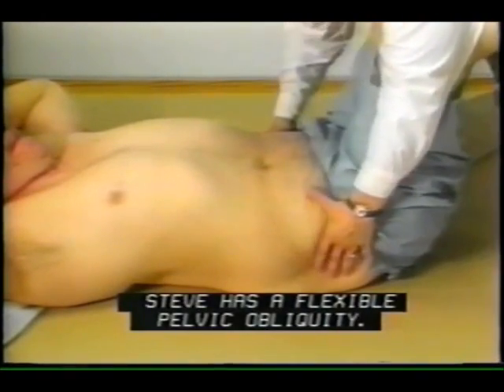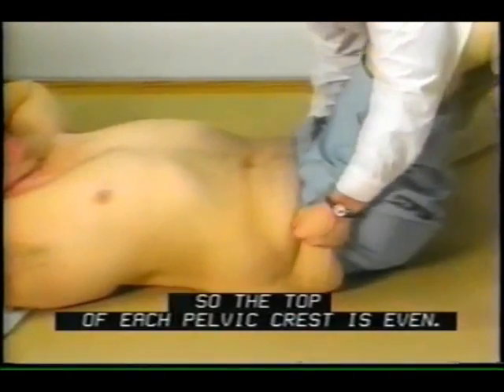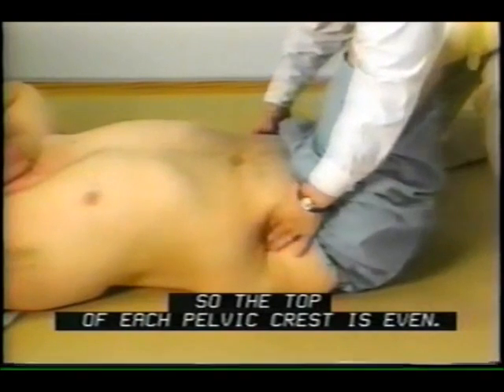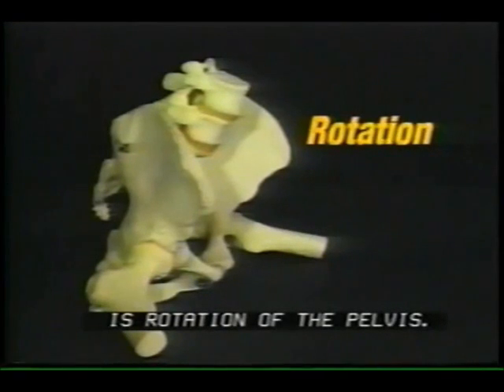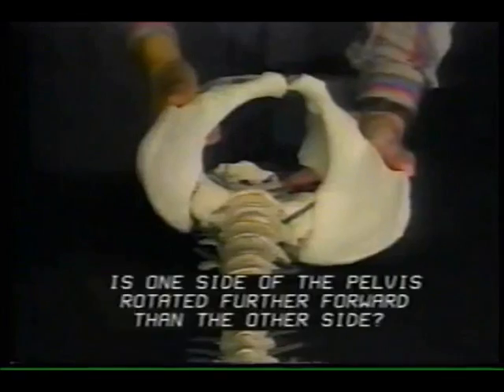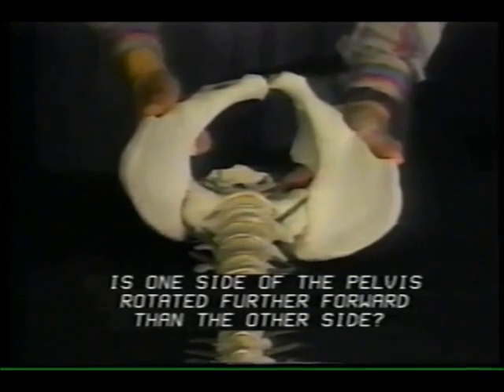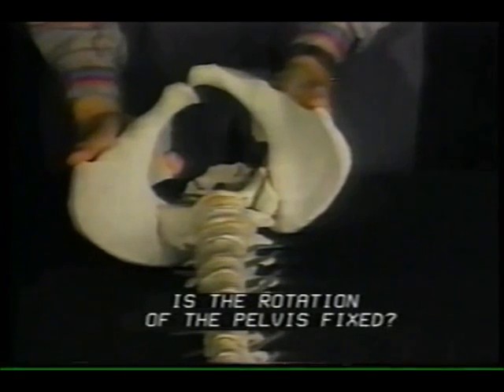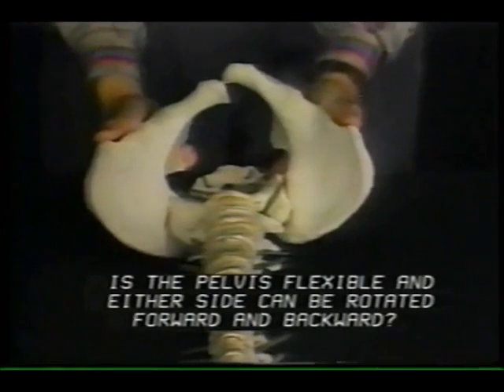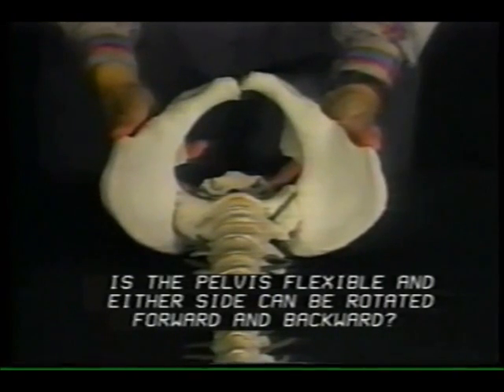Steve has a flexible pelvic obliquity. His pelvis can be positioned so the top of each pelvic crest is even. The last passive pelvic movement we assess is rotation of the pelvis. Is one side of the pelvis rotated further forward than the other side? Is the rotation of the pelvis fixed? Is the pelvis flexible and either side can be rotated forward and backward?